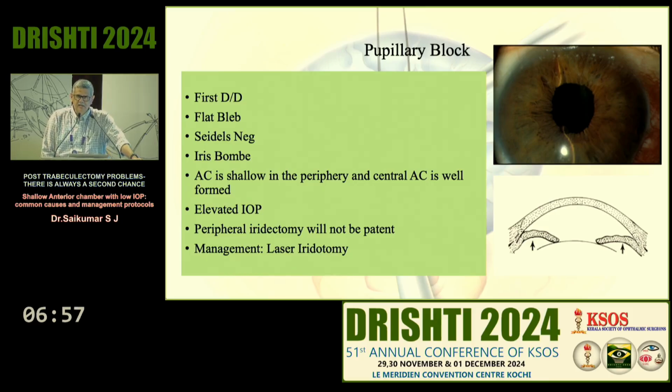So you do a laser iridotomy where there is an iris bombé and you puncture the iris, you let out the fluid and the block is immediately relieved.